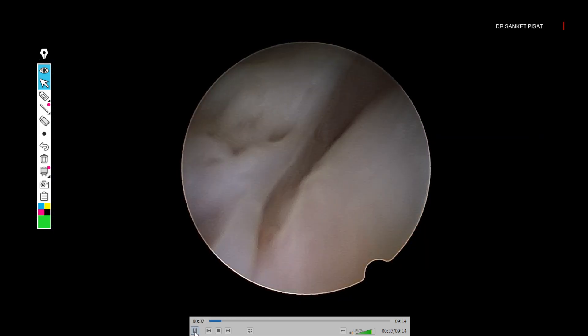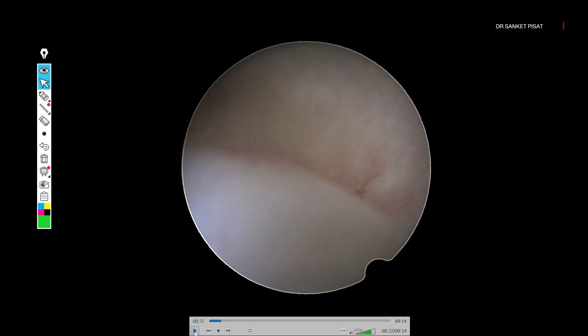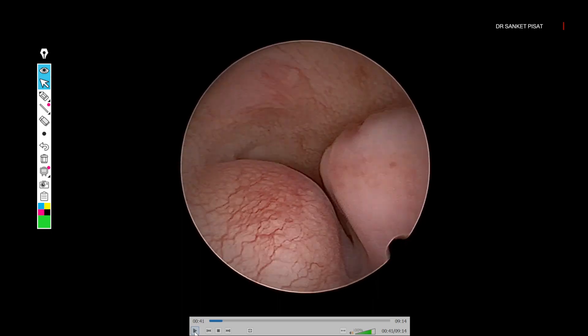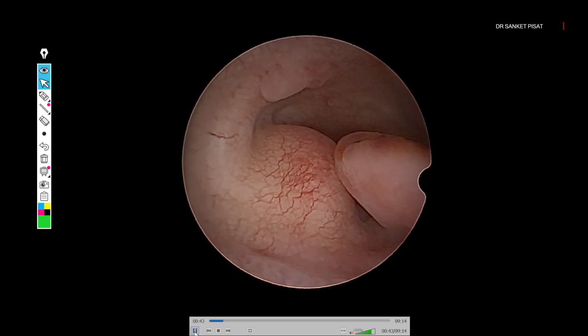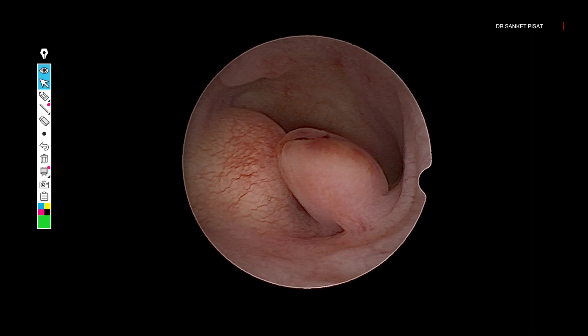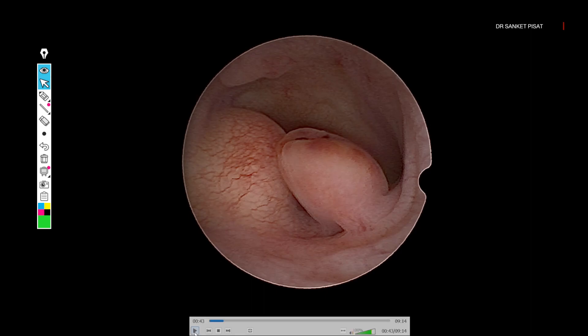The first step is always to do diagnostic hysteroscopy — do not go in with the resectoscope first. If you have a 26 or 22 French resectoscope, some dilatation will be required and that may induce artifact. What I am doing here is diagnostic hysteroscopy with minimal distension. This allows the fibroid to bulge inside the cavity. If you keep a very high distension pressure, the fibroid will get pushed out and will not be seen to the eye at all — you are going to see that as the video comes up.